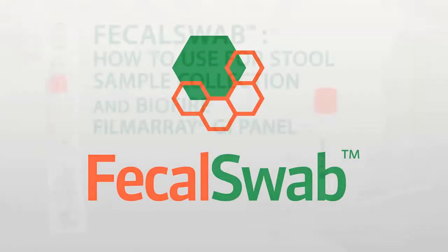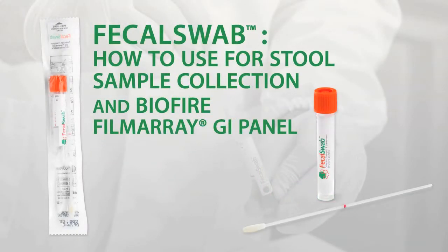Fecal Swab: How to Use for Stool Sample Collection. Each Fecal Swab kit consists of a sterile peel pouch, a regular nylon flock swab, and a screw cap tube containing 2 mL of Carey Blair medium.